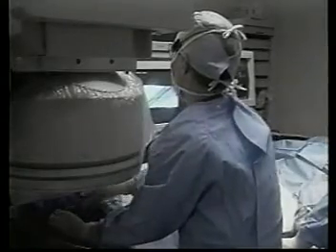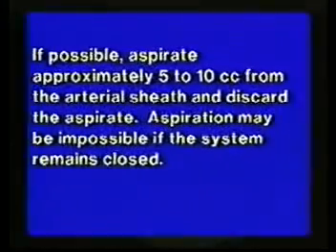Deflate and remove the balloon catheter. Using the arterial sheath, insert the PTD in the compressed position to the arterial plug. Deploy the fragmentation basket. Activate the rotator to break up the arterial plug. Place the device in the compressed position and remove from the sheath.